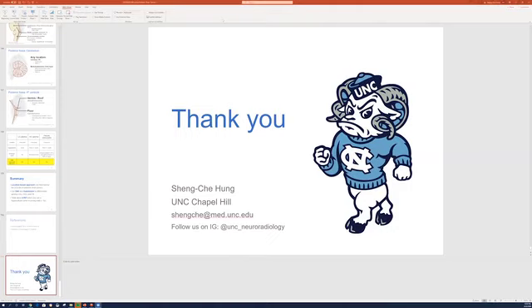Thank you for that amazing lecture. Is there any image clue to differentiate supratentorial ependymoma and the ATRT? As I said, ependymoma tends to have more calcification than hemorrhage, usually lies in the white matter, and less commonly has CSF spread. But ATRT is much more likely to have CSF spread and show as a high-grade tumor. That's what I thought. But if you see some calcifications, that would be a very important hint to differentiate ependymoma and ATRT.